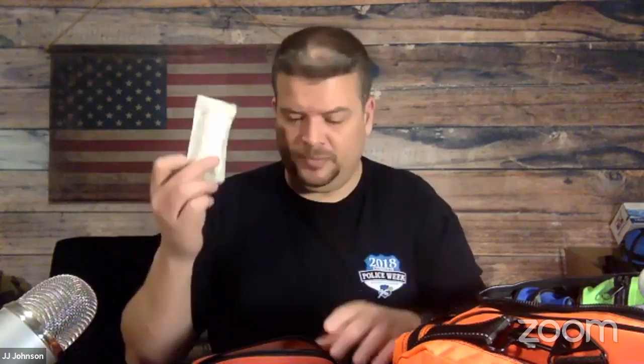So we have a whole bunch of Steri-Strips in here. We've got some tape. We've got some QuikClot, Sport QuikClot. This is going to be a nightmare to get back in here, probably. Small ace bandage. And you can wrap these things wide and tight, and you can use those as a constriction band. You may not be able to use it as a tourniquet, but it'll get close. Then you've got some more rolled gauze here. I got a whole bunch of 4x4s. Each one of these packages, I think. Got two triangular bandages.